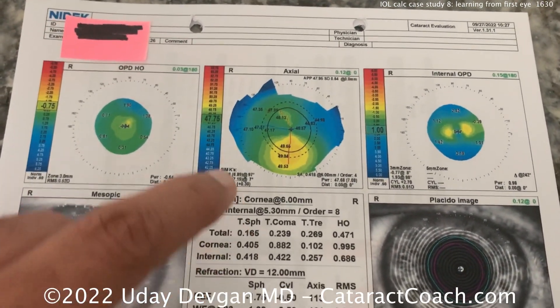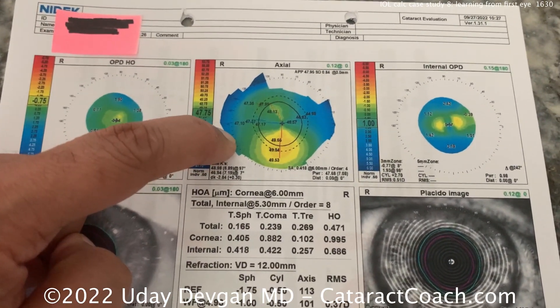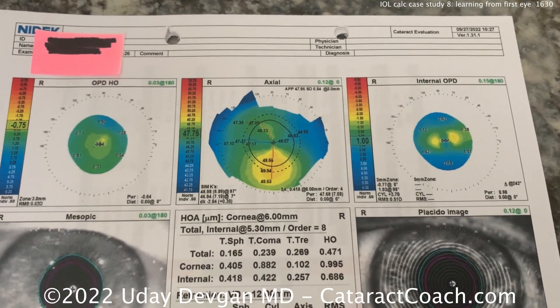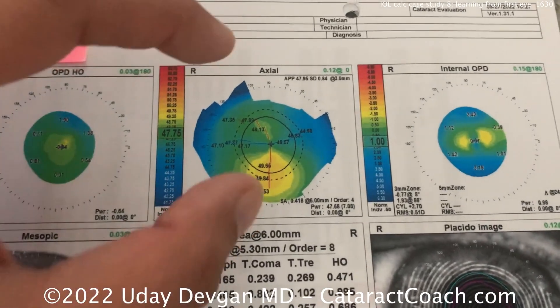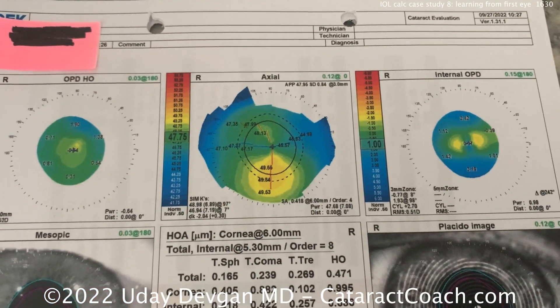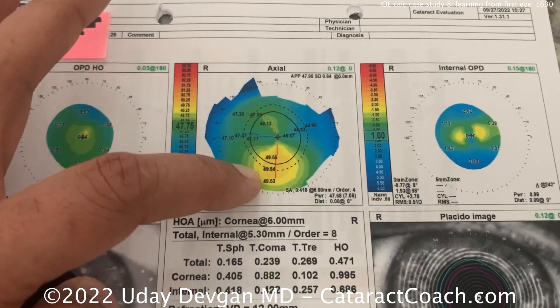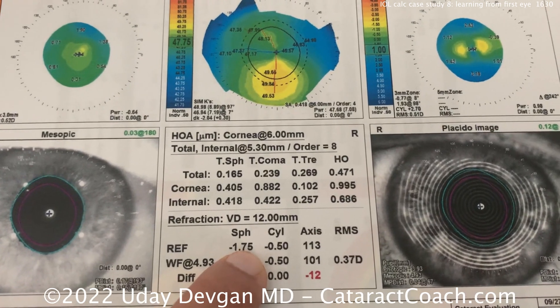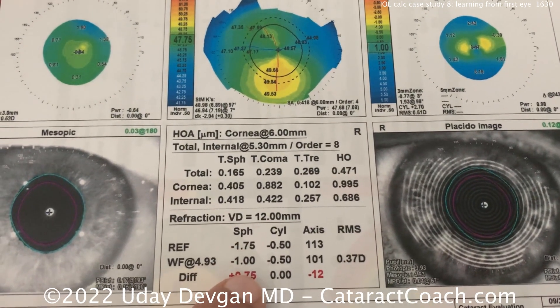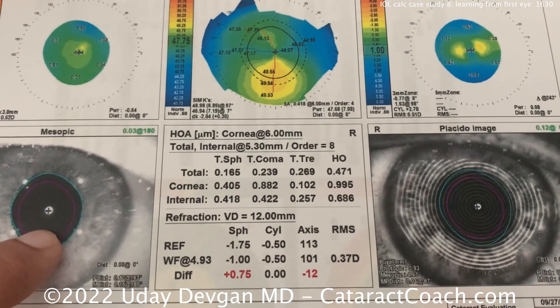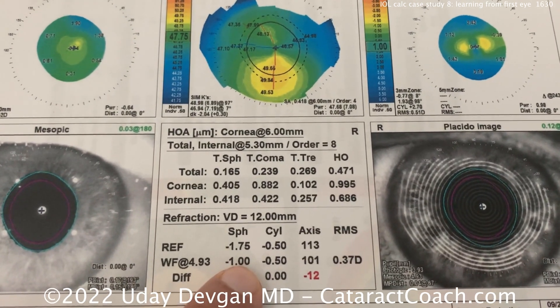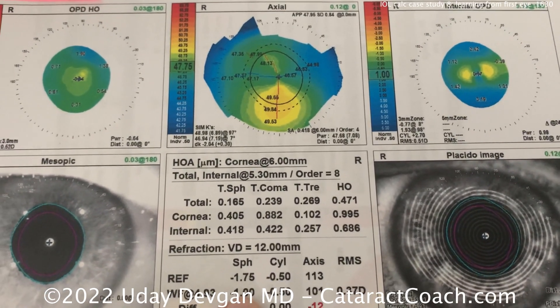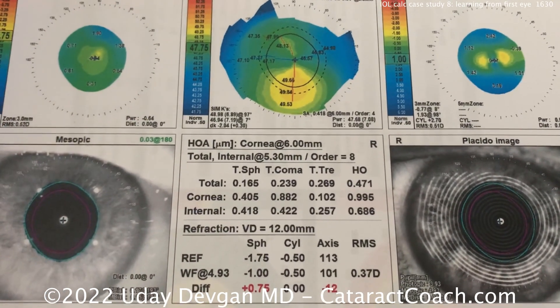This is post-op. He's been six weeks post-op now in the right eye. You can see even a little more asymmetry than before, which may account for some of the irregularity and maybe some of the refractive outcome. The extended depth of focus lens can sometimes confuse the autorefractor. At a larger 4.93 mm pupil it's about a minus one, and that's what he is subjectively. Minus one gets him to a very happy 20/25 vision in this right eye, which is pseudophakic.